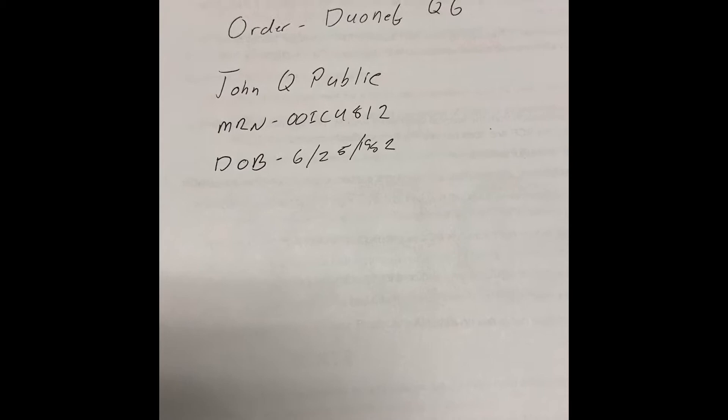First you're gonna need an order, a patient's name, MRN, and date of birth. Here we have a DuoNeb Q6 or get your med from the center.